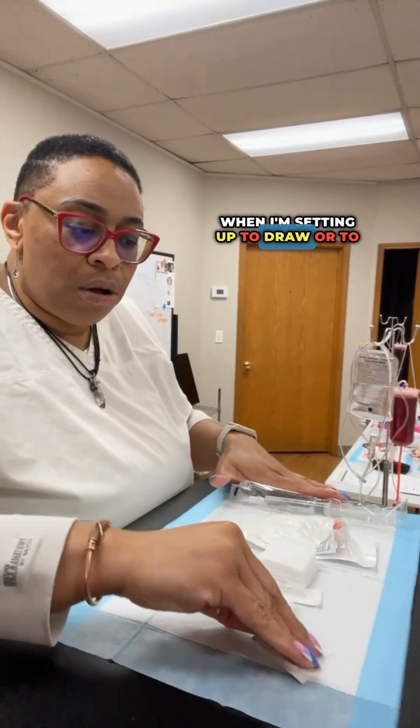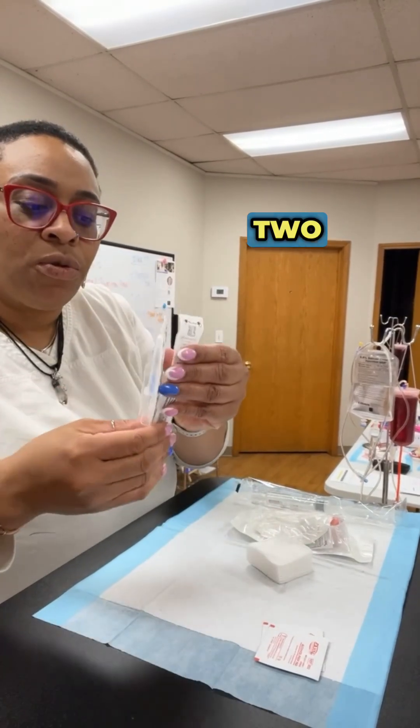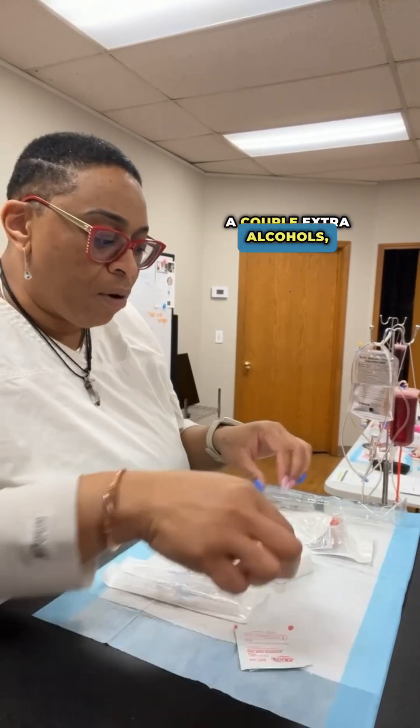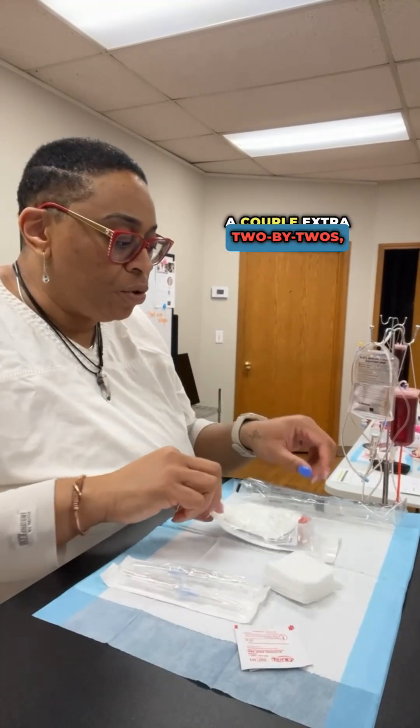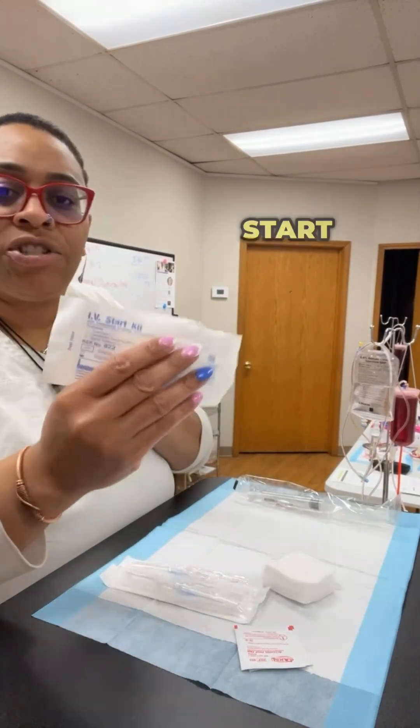When I'm setting up to draw or to start an IV on a patient, I prefer to bring two IV catheters, a couple extra alcohols, a couple extra two-by-twos, my flush for my IV, and my IV start kit.